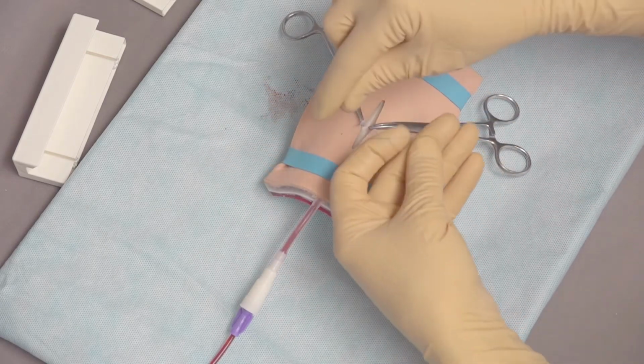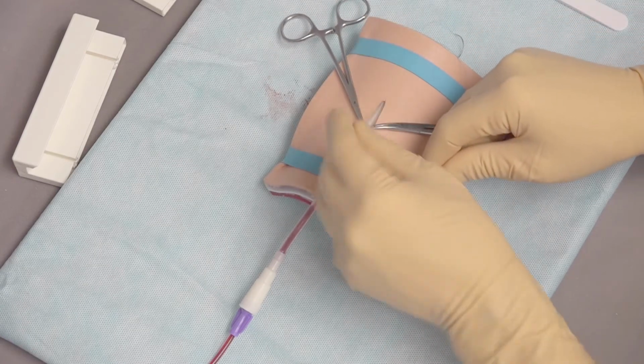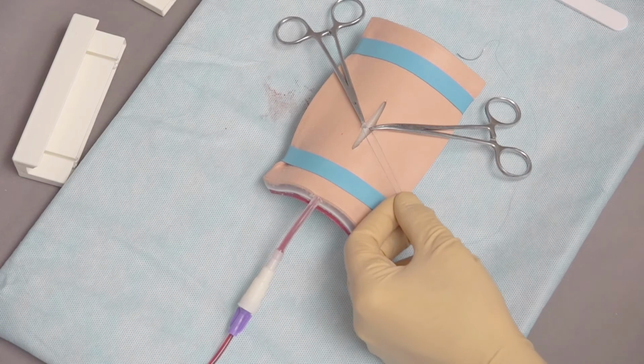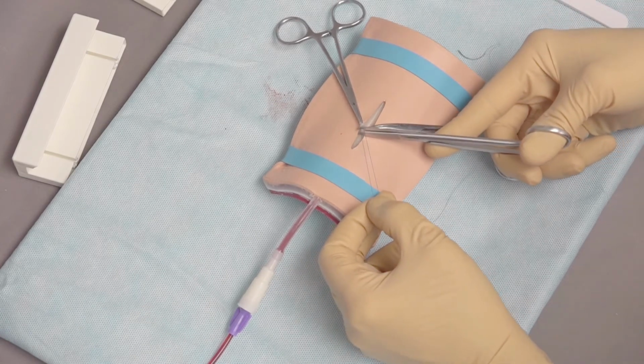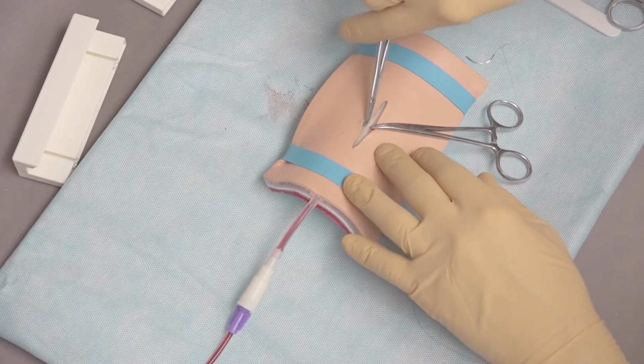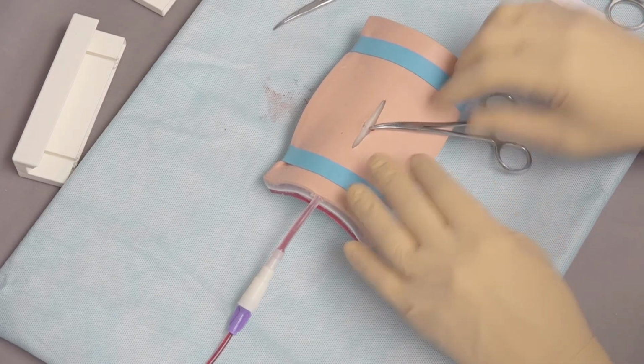Coming through there. So we have four throw square knot on the vessel. Careful now to come in. We're going to cut these short because they're staying in the abdomen. Now, if we've done our job right, when I let go of this, it should have hemostasis. That one looks good.